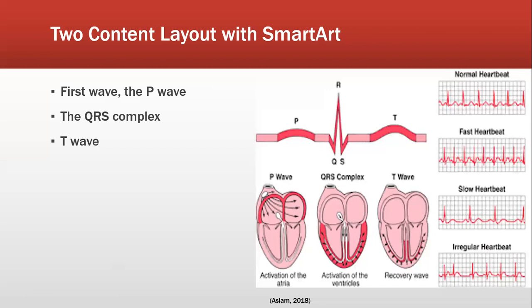So using this, if they see an increased or decreased P wave, this can indicate problems with the potassium ion concentration in the body, and that's going to alter nerve activity. So a missing P wave indicates an atrial fibrillation, or cardiac arrhythmia, in which the heart beats irregularly, preventing efficient ventricular diastole. Generally not fatal on its own, but obviously a sign that there is an issue with the heart.